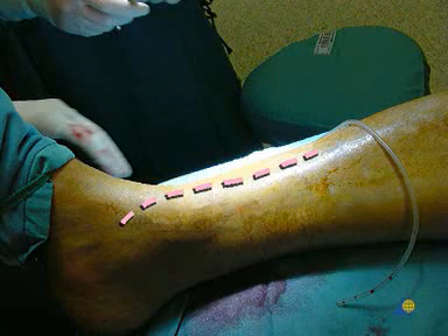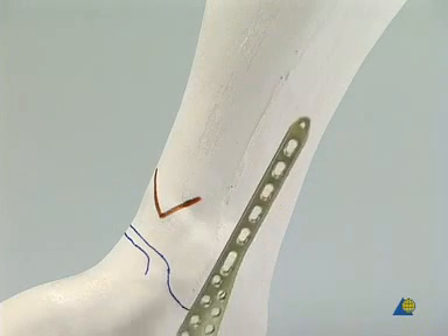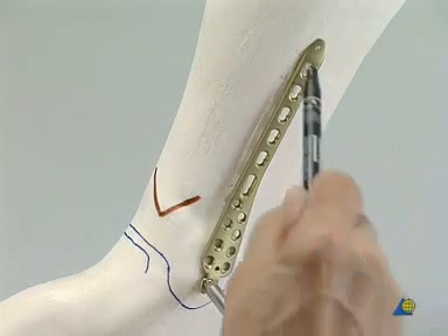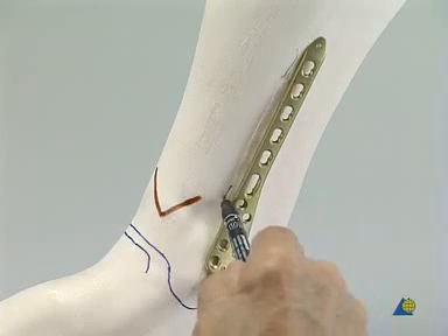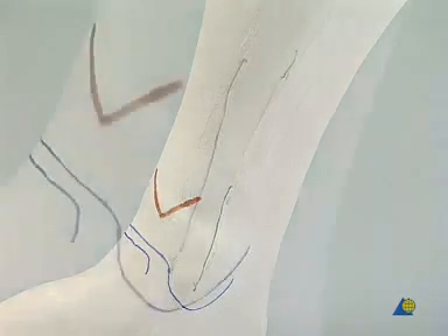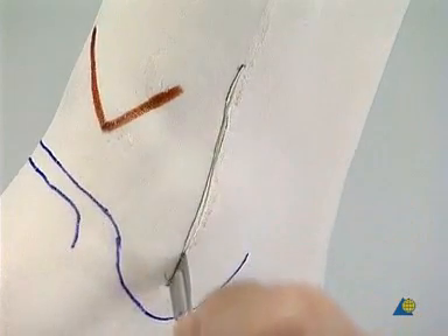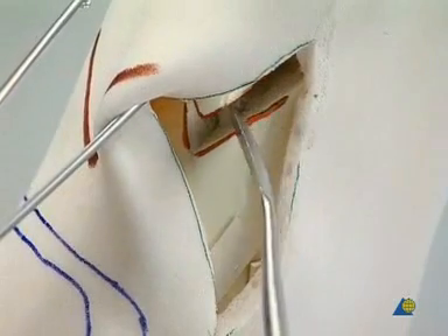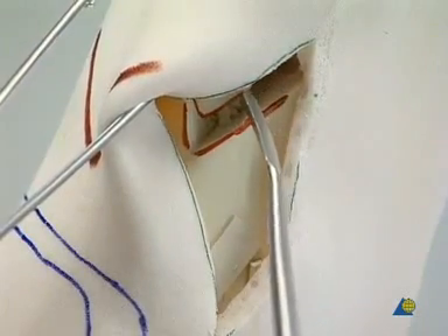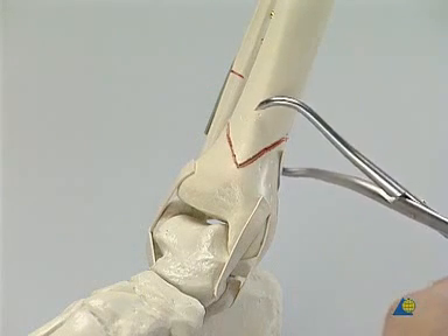Instead of a traditional extensive approach, several short incisions were chosen. For guidance, the LCP distal tibia plate is positioned over the medial side of the leg to plan the incisions. For the anatomical reduction of this short oblique fracture, a slightly longer distal incision is needed so that the fracture can be seen and the pointed reduction forceps can be introduced. The soft tissues are gently retracted to allow minimal exposure of the fracture. In the clinical situation, the fracture would be cleaned of hematoma so that it could be precisely reduced. The fracture is reduced directly by manipulation and by using the pointed reduction forceps. Care must be taken that the forceps do not block the entry point for the crucial lag screw.